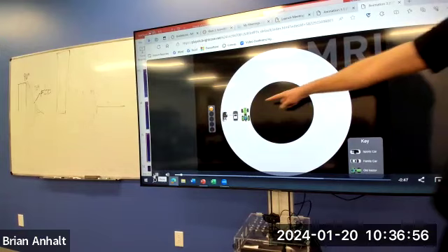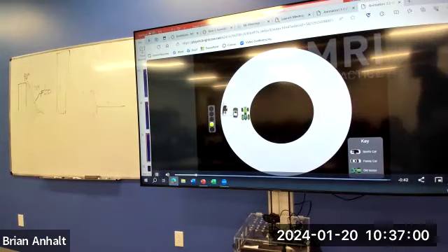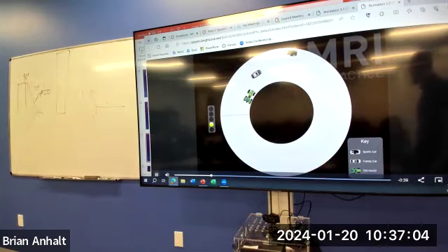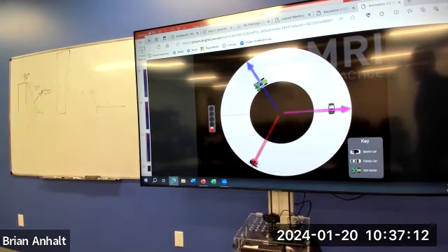Cars pushed into phase at the beginning of the race, right? We're gonna have some of them that are faster than others. They're gonna immediately start going out of phase. Like the protons, some of them are precessing at higher rates than others because they're in stronger areas of the magnetic field. Go out of phase. 180-degree flip.